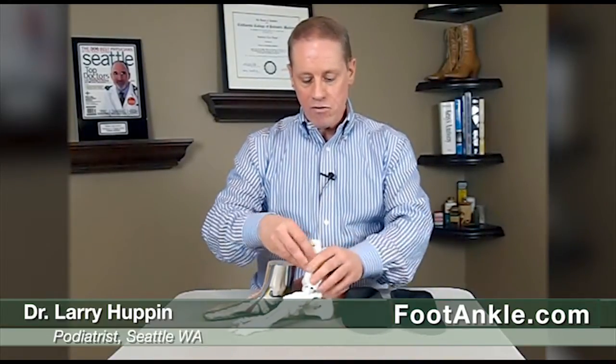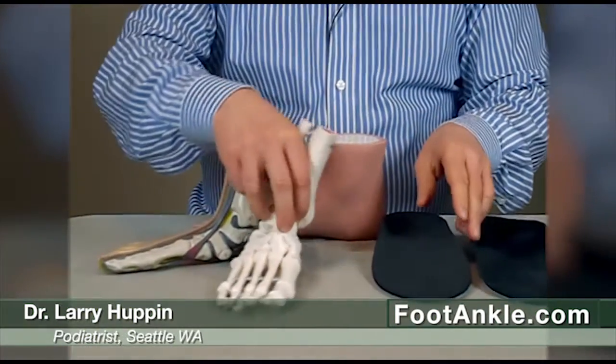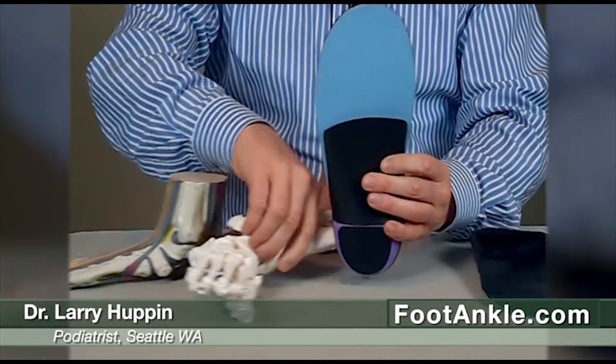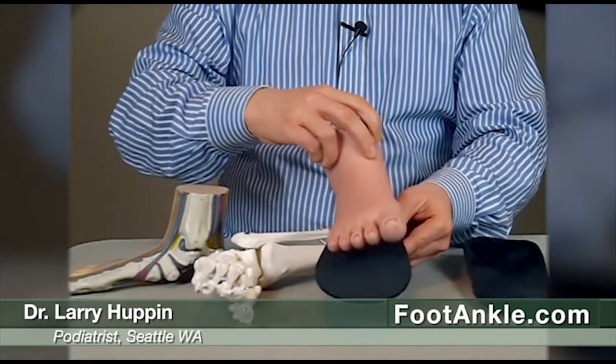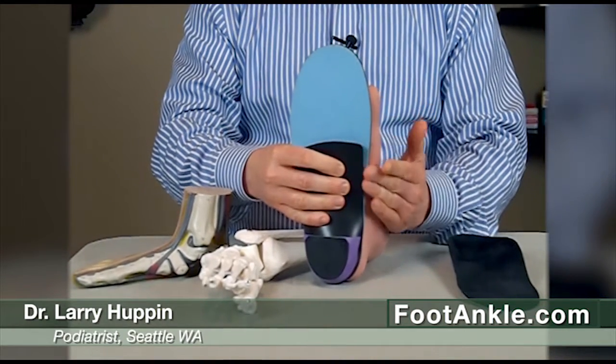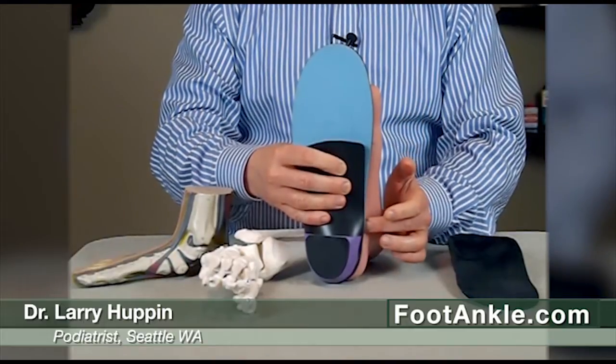The problem is that people with flat feet, when the foot flattens, it tends to splay out a lot to the outside. And when you put that type of foot onto a normal orthotic device — and this kind of demonstrates a normal width orthotic — the problem is they come down right on the edge of the orthotic. The foot ends up wider than the orthotic is, and this edge can lead to a lot of pain.